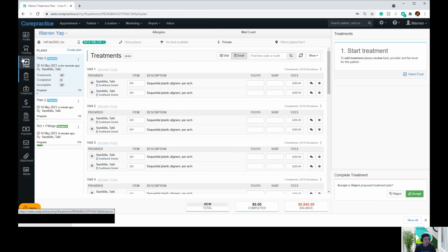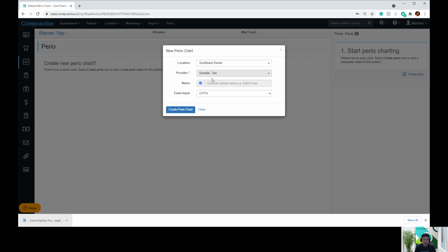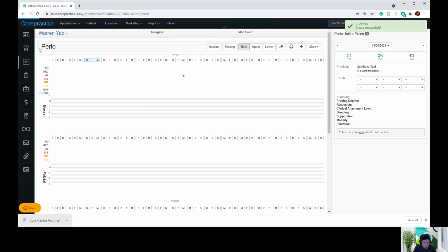Now I'll move more into the perio charting. If you don't really do a lot of perio charting, you can skip over it. That's fine. This should only take about 2 to 3 minutes. So you can see once again, we've got the perio chart guide. It's asking us to create perio. You've got 2 exam inputs, CPITN and PSR. Choose the one that you like or use the most. And we'll go with CPITN.